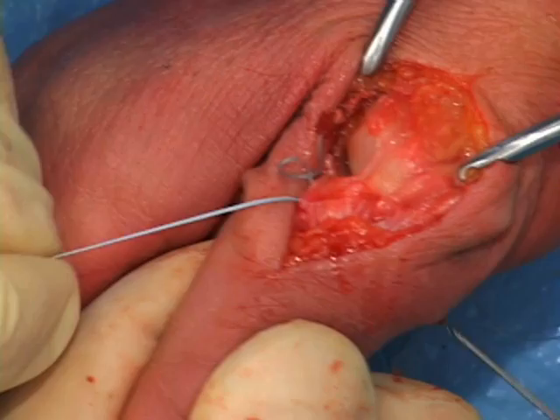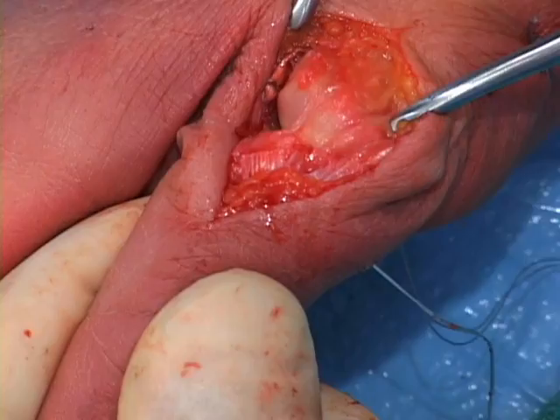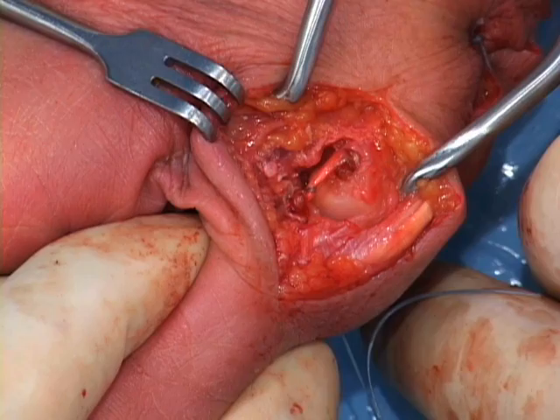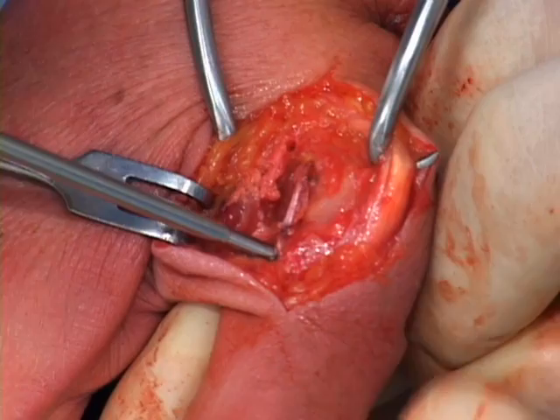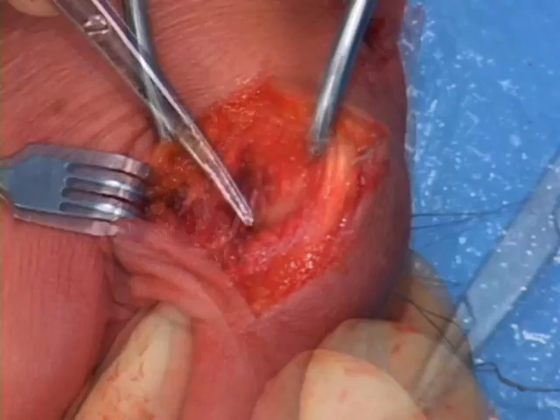Use the same suture passing technique on the phalangeal side, drawing the whip-stitched fiber loop sutures out the radial side of the thumb. Reduce the metacarpophalangeal joint and tension the graft into the phalangeal drill hole by pulling the fiber wire radially. Closure of the abductor aponeurosis and other structures, as well as post-op protocol, are per surgeon preference.